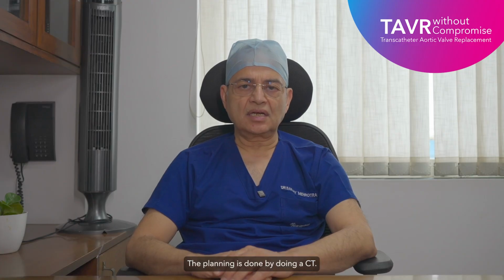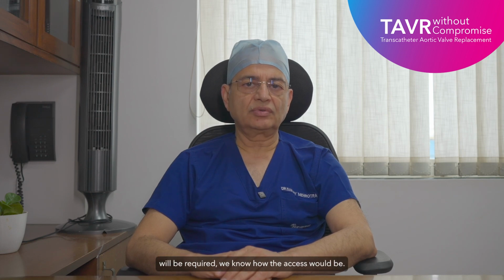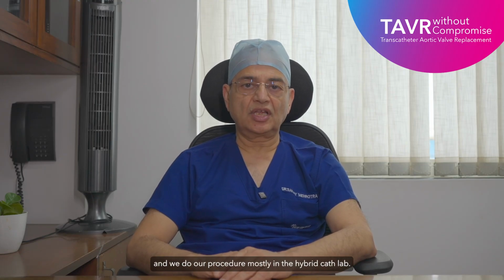The planning is done, as I said, by doing a CT. We know the size of the valve which will be required. We know how the access would be. And to guide our procedure, which is controlled by X-ray, because the procedure is done in the cath lab, and we do our procedure mostly in the hybrid cath lab.